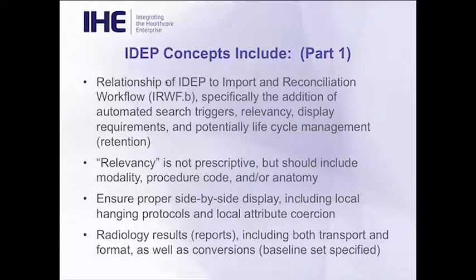Okay, so thank you. So to go back to the more technical side of things again, some of the concepts that we discussed when actually developing the profile for IDEP include the relationship of IDEP to an existing IHE radiology profile called the Import and Reconciliation Workflow, or IRWF.B profile, which focuses on importing DICOM DVDs in quite successfully.